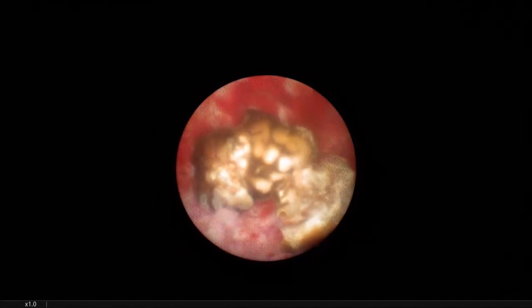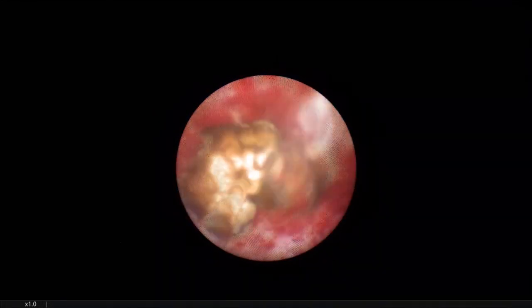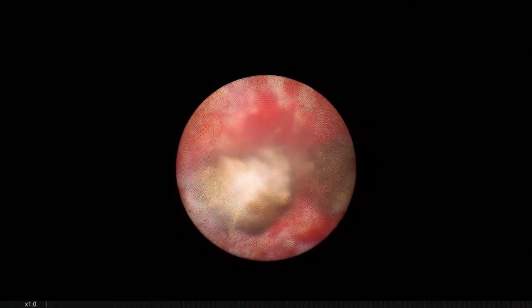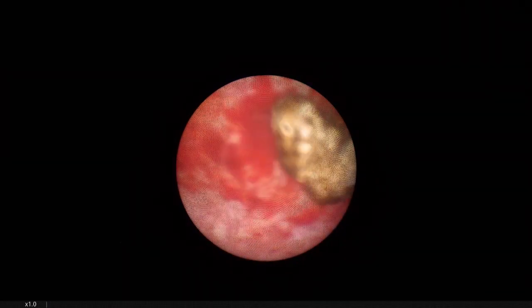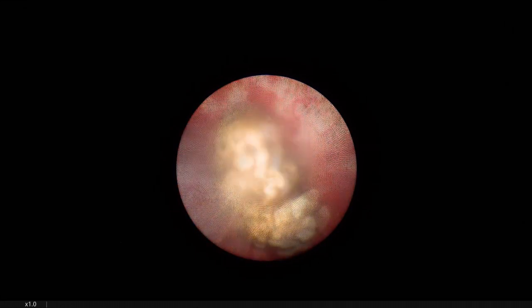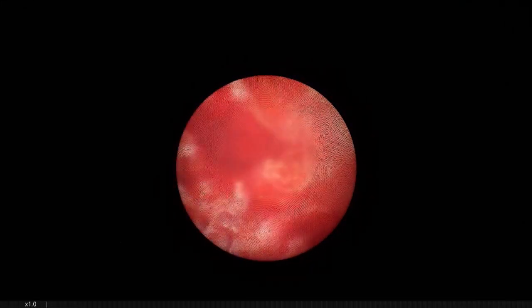And what we can see is that the stone fragments do not migrate. But it might go through in another calyx. No? No. The balloon is preventing the downward migration, but yeah, it might go somewhere else in the mid-calyx or... Very hard stone.